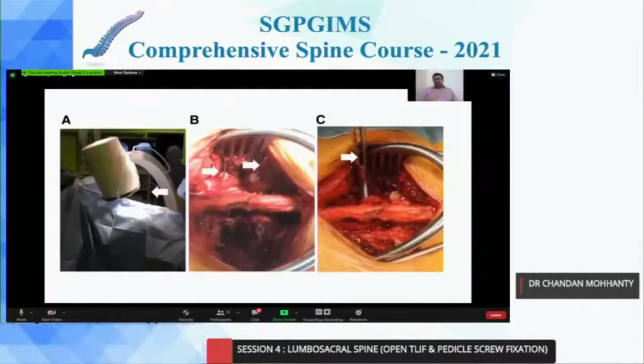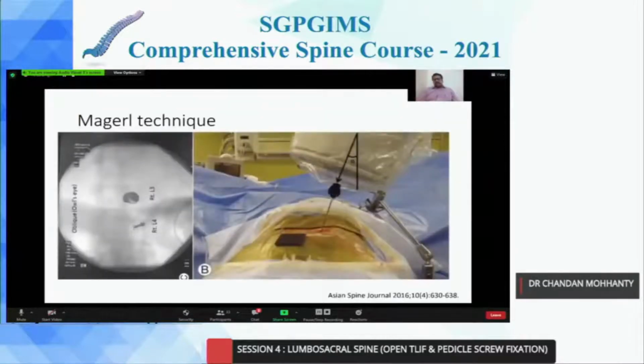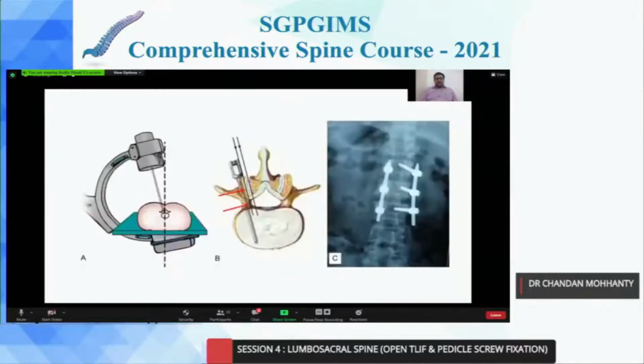So this is how the C-arm is tilted to get our pedicle axis view. This is the degree that we have usually calculated beforehand based on our CT or on our MRI. So this is how the machine needs to be placed in a patient. However, this is not the right way to take the image, as we have shown in the previous part, from the point of view of radiation safety, since the X-ray tube needs to be under the patient and not above the patient.